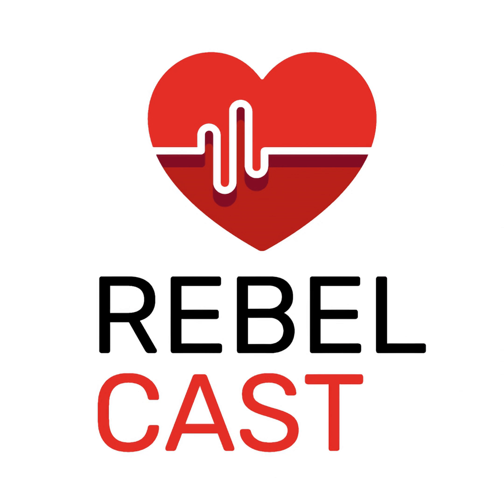Okay, so that's pretty straightforward. We just need to set up the ventilator. You can choose any mode you want: AC volume, AC pressure, or PRVC. I wouldn't choose pressure support right off the bat, because maybe you've paralyzed this patient and they're not going to trigger. So you have any mode at your disposal. That's the first thing: choose your mode.